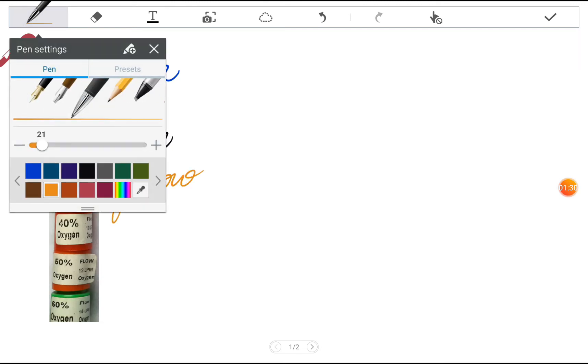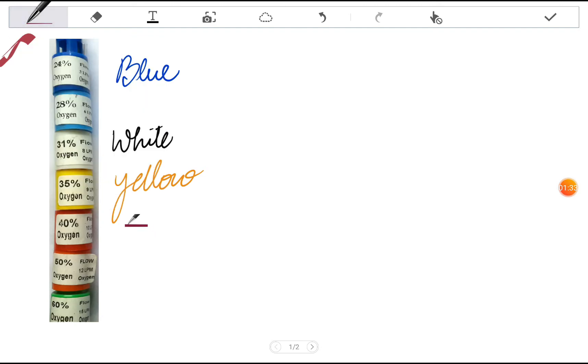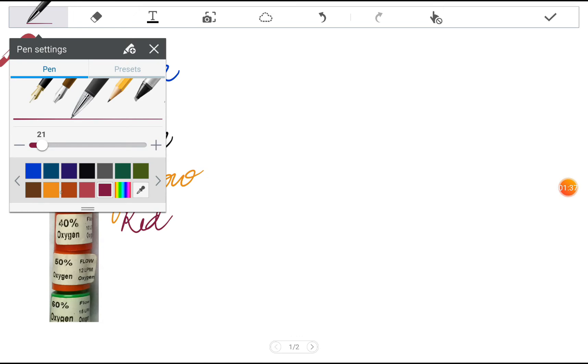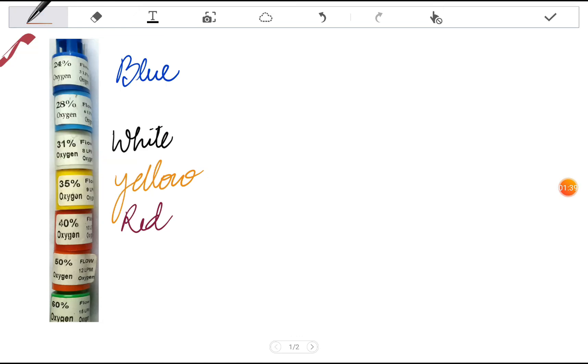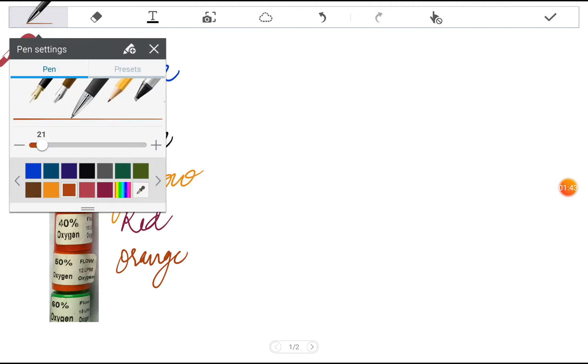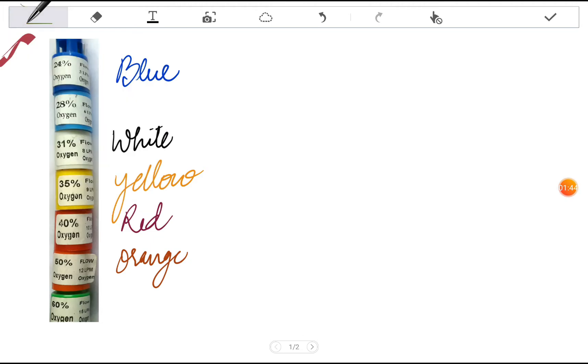Then we go with the red one, orange, and then the green one. The color coding is basically done to differentiate between the different attachments due to their difference in flow rates.